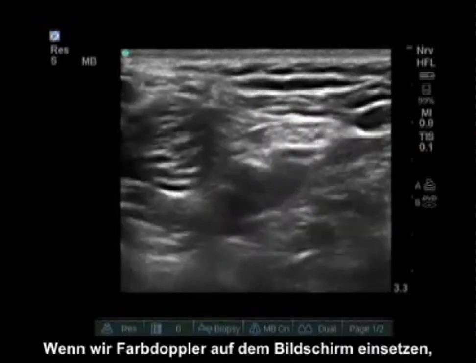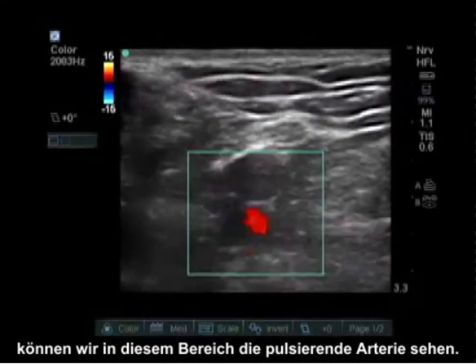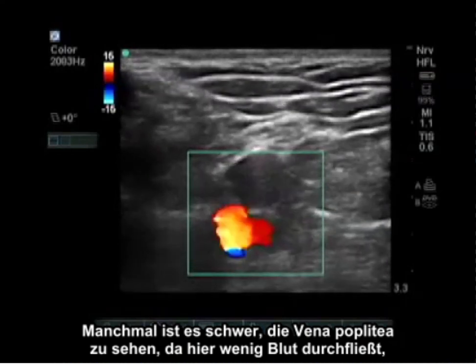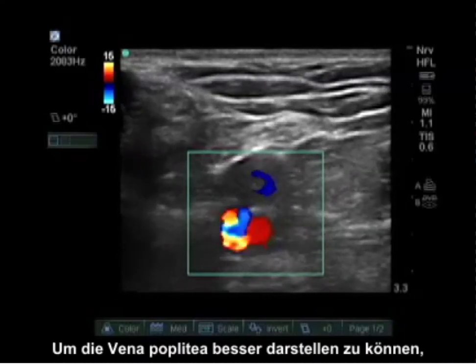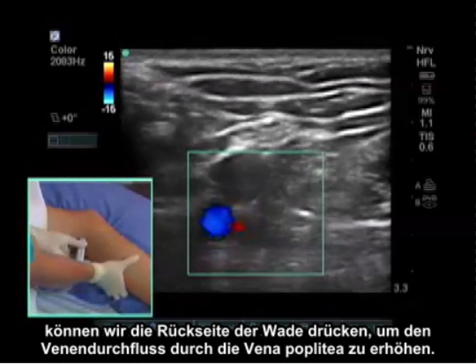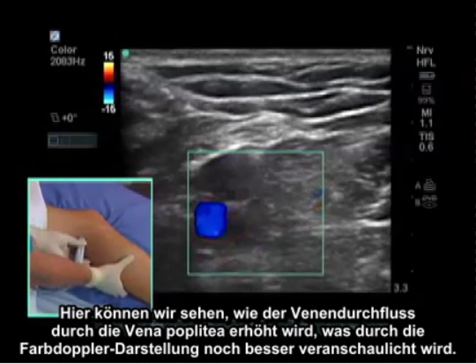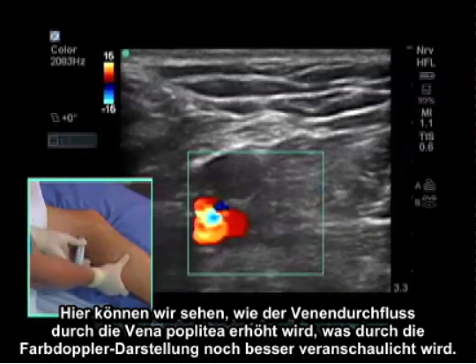If we put color Doppler on the screen we are able to see the pulsating artery in this area. Sometimes it is difficult to see the popliteal vein because this is a low flow state. To visualize the popliteal vein better we can squeeze the back of the calf, increasing venous flow through the popliteal vein. There we can see increased venous flow through the popliteal vein represented better by color Doppler.